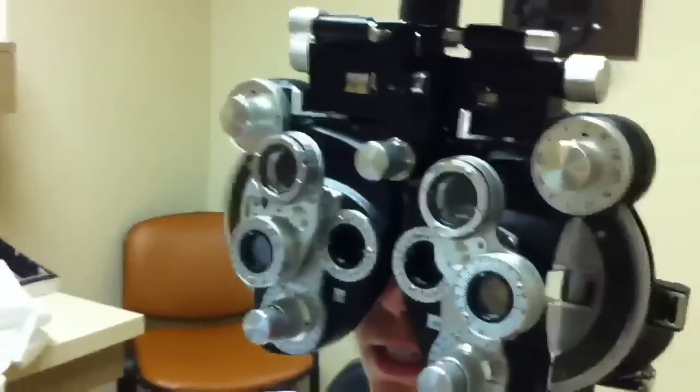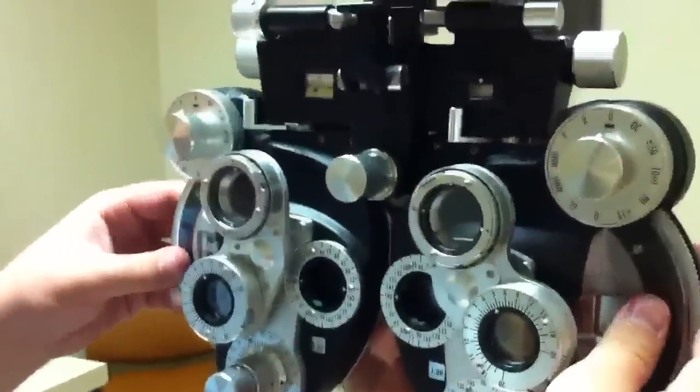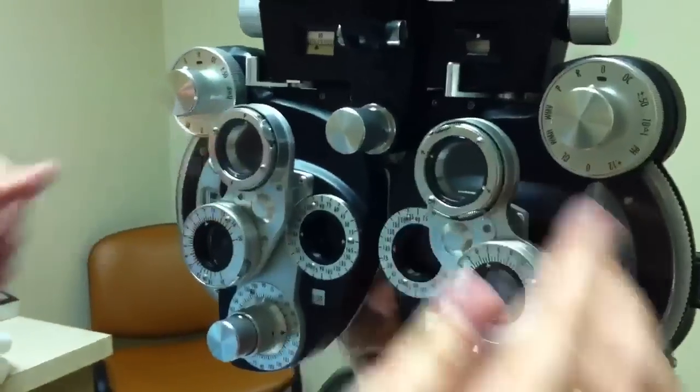Does that look okay, Annika? Yes. Can you see the chart? Yes. I know the room's bright — usually we have the room dark, but so we can see with the camera, we're going to have a look at the right eye.